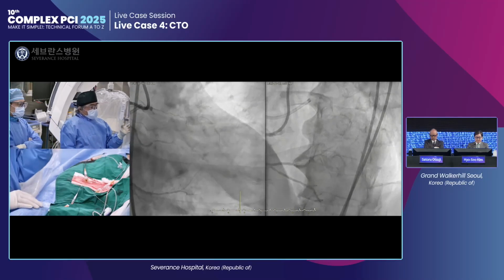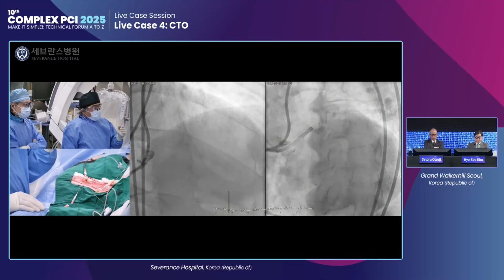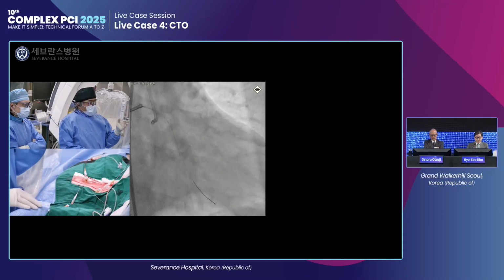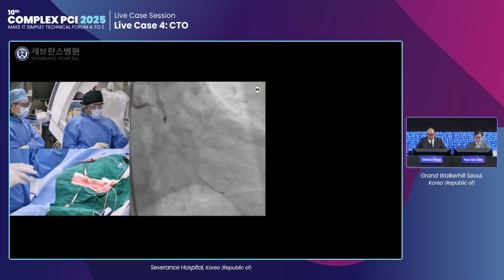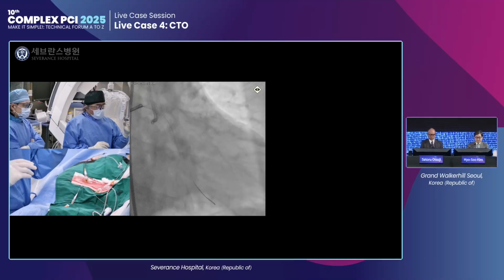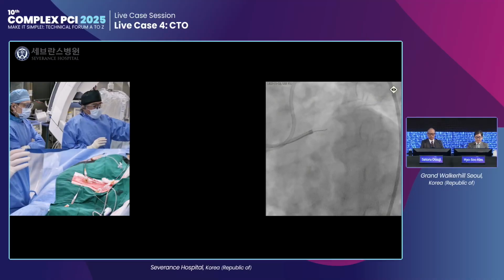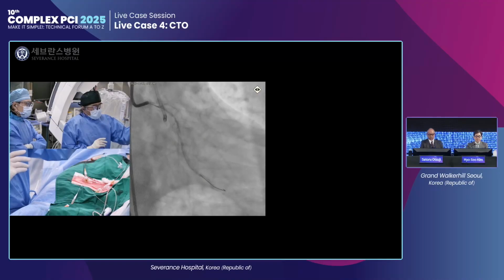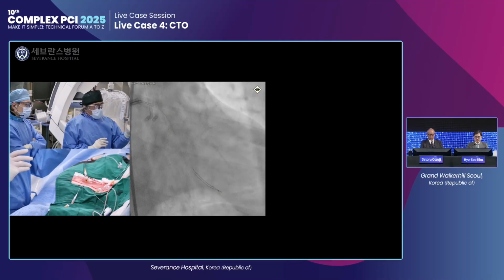We can see some promising septal channel. Next one. So this is the circumflex wiring, and then we can check with IVUS the real LAD ostial location. This is the wire movement of the LAD. However, this is very acute bending, so not easy.